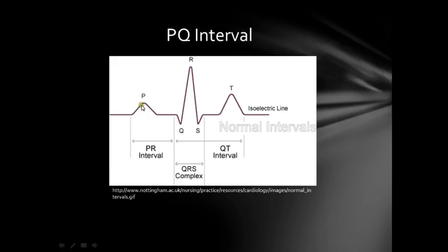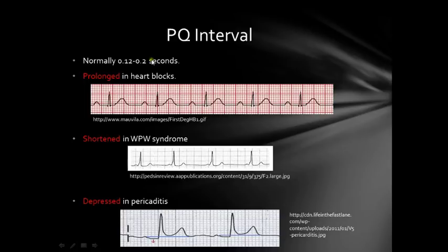The next thing after the P wave is the PQ interval. People commonly call it PR interval, but I prefer PQ interval because it goes from the P to the beginning of the Q wave — not to the tip, but to the beginning of the Q wave. From the beginning of the P wave to the beginning of the Q wave — this is the PQ interval. Normally it is 0.12 to 0.2 seconds, that's three to five small squares. It is prolonged typically in heart blocks — you can see here the P wave and Q are more than one large square apart, so this is a prolonged PQ interval.